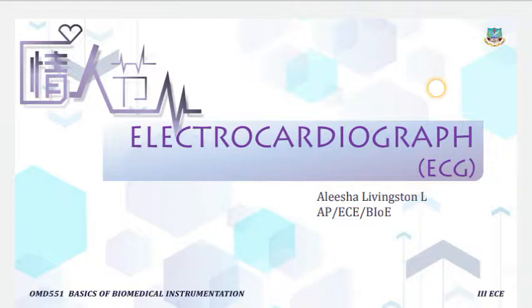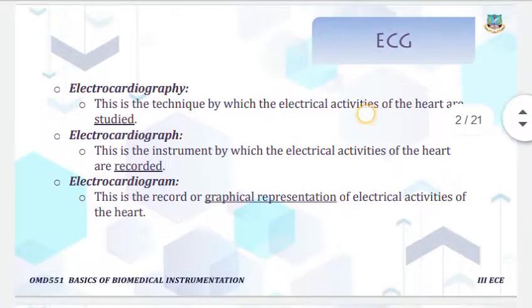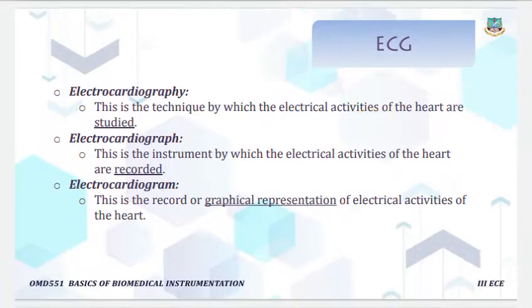Today we just start our topic, the electrocardiogram. I think many of you know about the electrocardiogram. Let's start. ECG: there are various terms, electrocardiography, electrocardiograph, electrocardiogram.